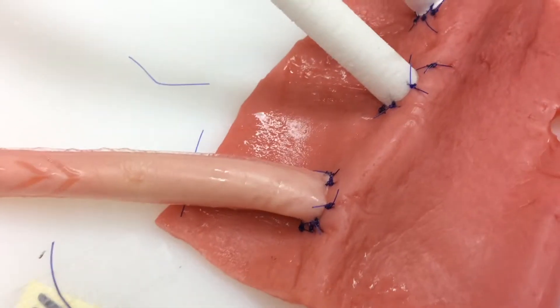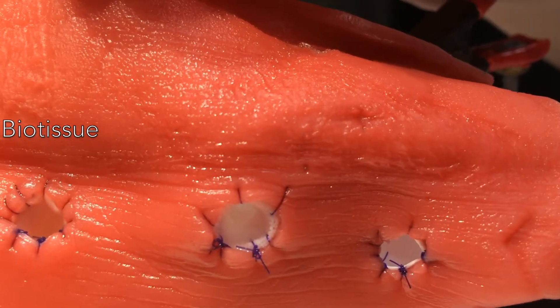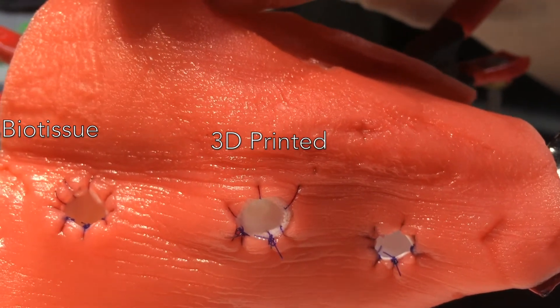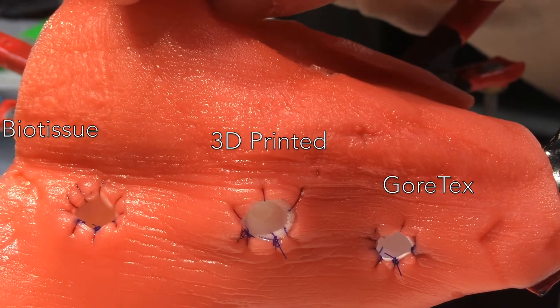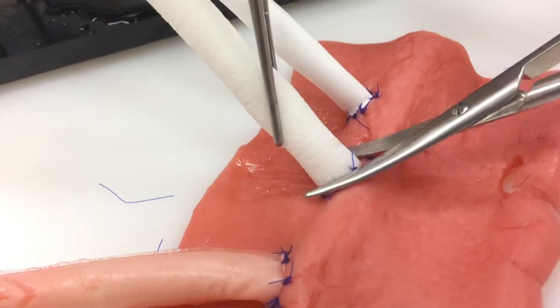After each anastomosis, the participants can take a look at their anastomosis from the inside out and see the result. Now it's time to cut them — let's see how they react.